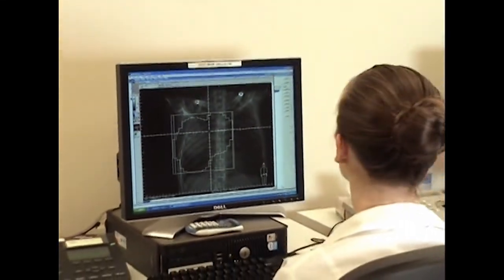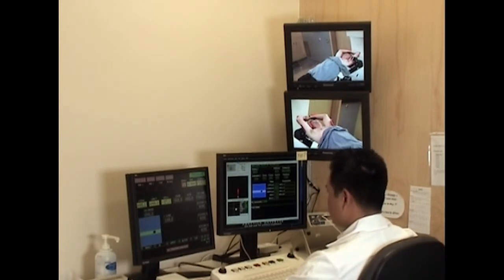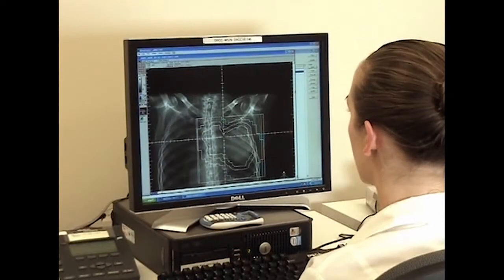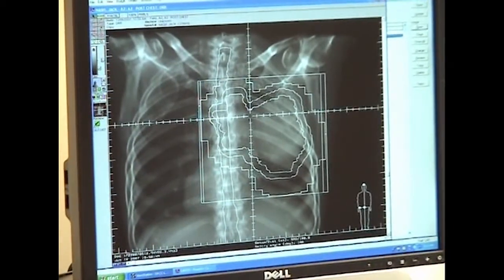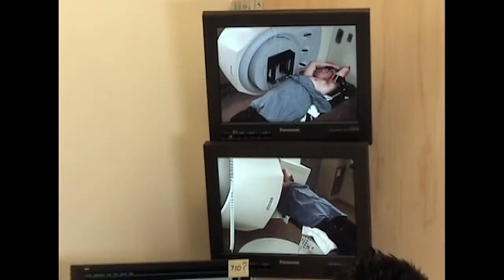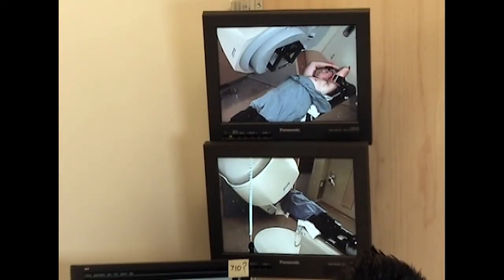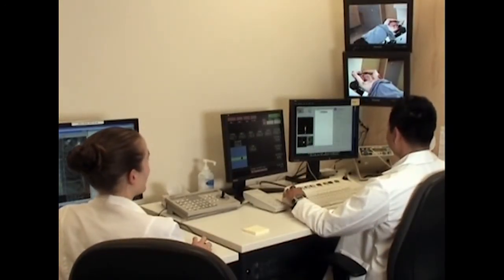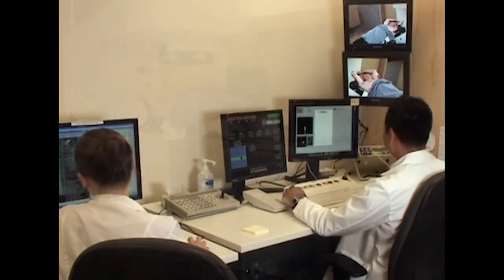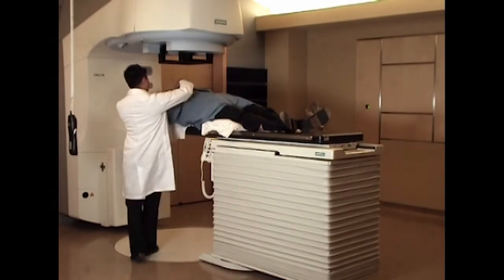By the third day, treatment setup may be done from outside of the treatment room, thus shortening the time you need to spend on the treatment couch. Your treatment time will depend on the area of your body being treated and the type of cancer involved. In general, treatment setup and delivery times are from 10 to 30 minutes per daily session. As previously mentioned, the overall duration of treatment is dependent on your unique needs and may vary from 1 to 39 days of daily radiation treatments.